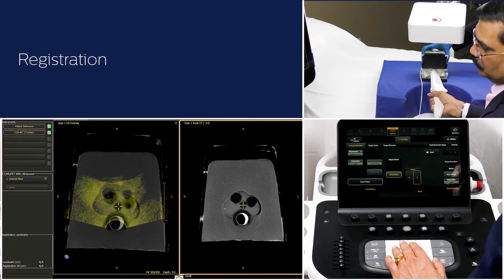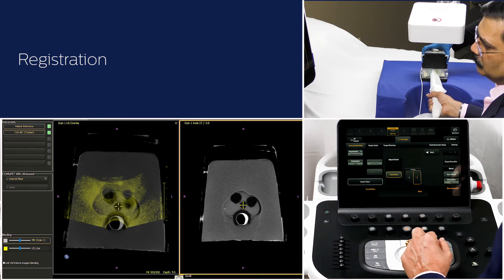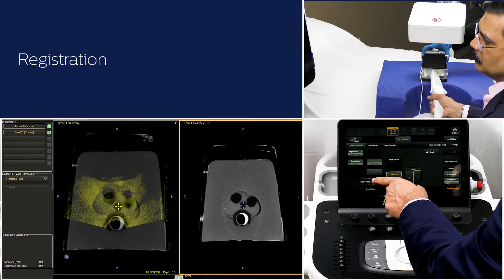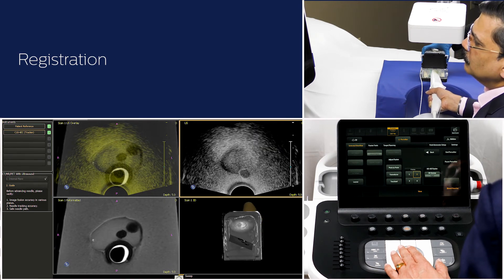Use the blend control to adjust the blend ratio to check the overlay match of images. You can also make minor adjustments with the transducer if needed. If you are satisfied with the ultrasound plane registration, then touch match plane. Scan different planes to verify accuracy of the image fusion.